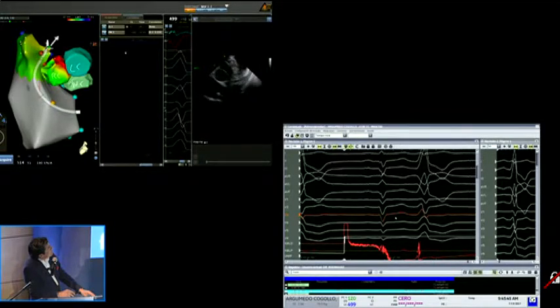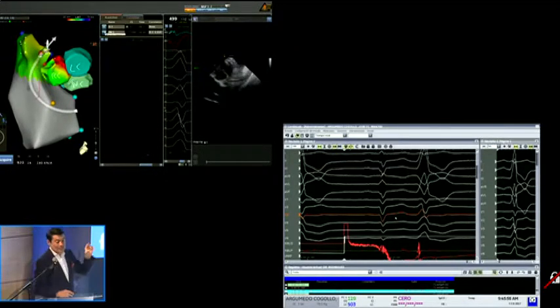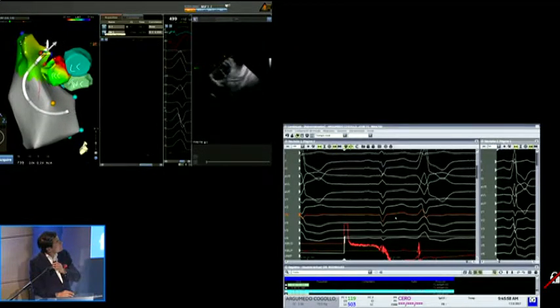No, it's not capturing. Please increase the output a little. Increase the output to 15, please. In real time, in the other screen, please show us the true cap, the true cap, David.